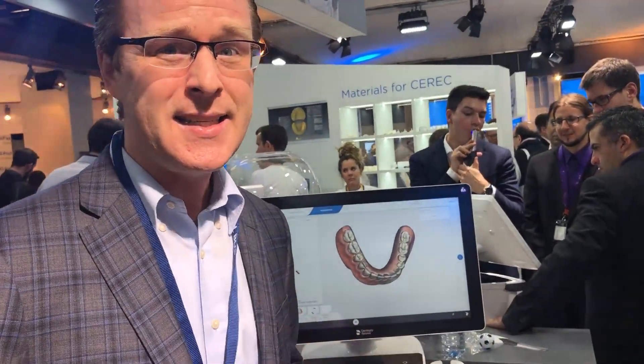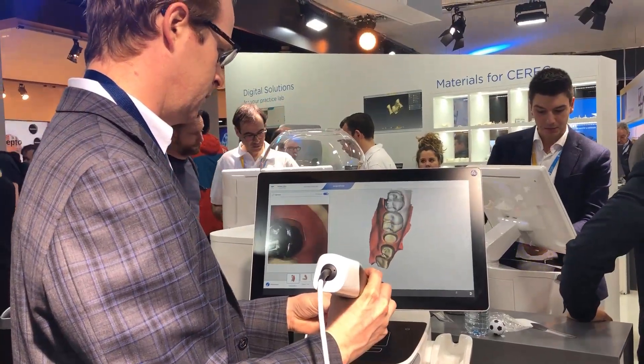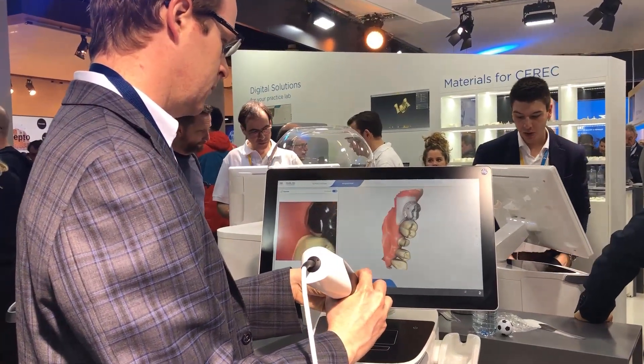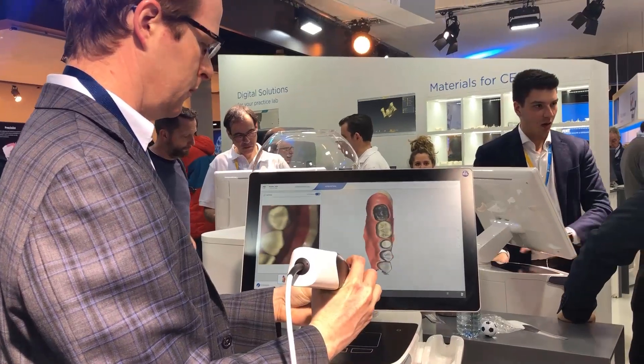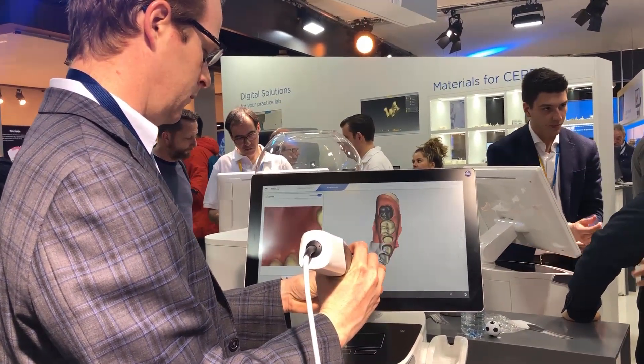With that being said, it is a fabulous scanner. It did a great job of scanning a very challenging new case. In addition, it does a great job of scanning traditional tooth dentistry, gold crowns, and other challenging scans.